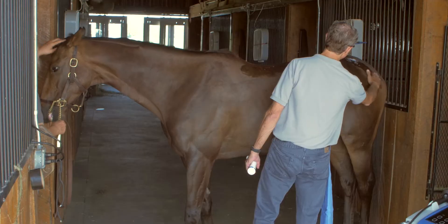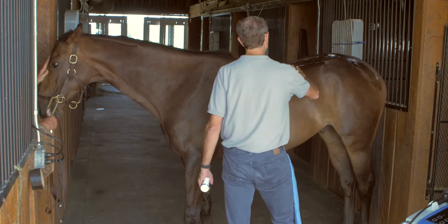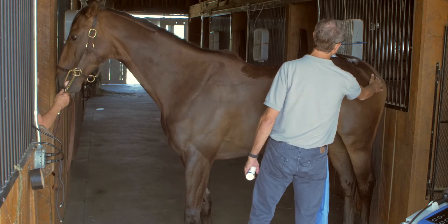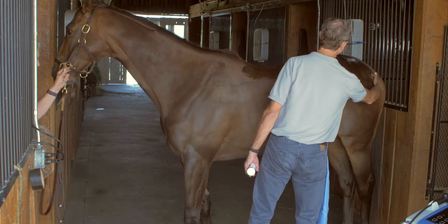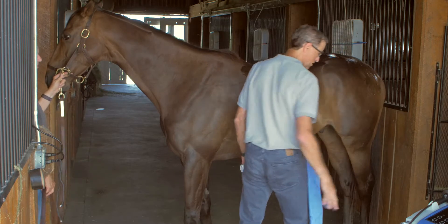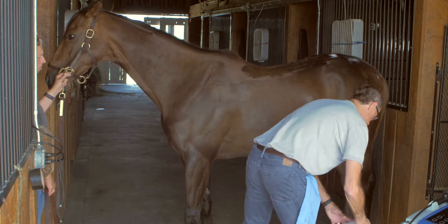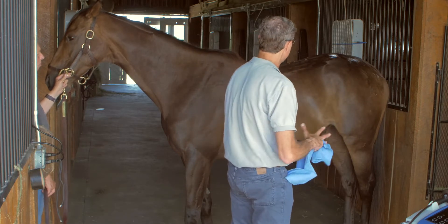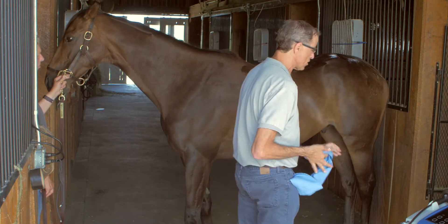This particular horse is in really good shape and this general treatment for a horse's back and gluteal region is just meant to demonstrate a routine treatment. We've prepared the left side from the withers all the way back to the glutes.